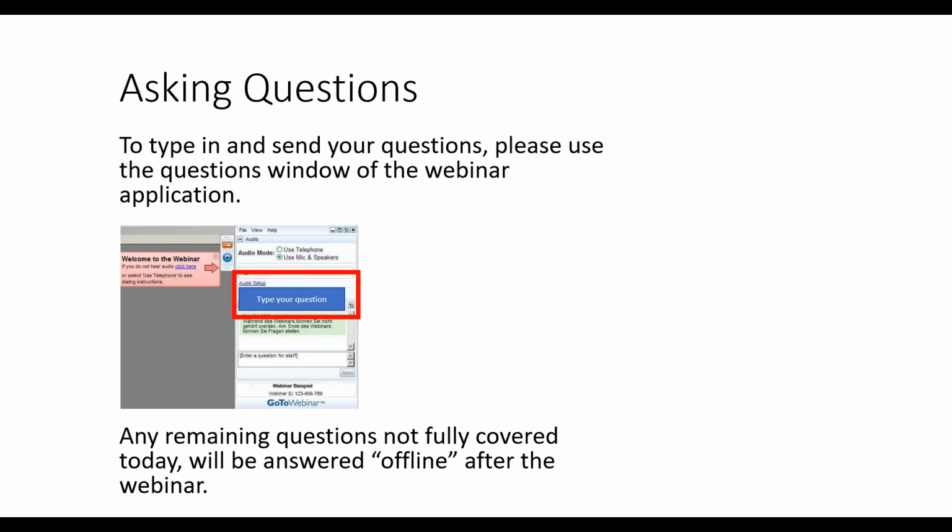You were mainly talking about the microsecond pulsing laser. Are there situations in which you use the threshold laser for CSC, either as additional or as primary care? Thank you very much. I still do, yes. If there is a focal leakage, as shown on fluorescein angiogram, I just use focal photocoagulation as opposed to this diffuse, panmacular micropulsing.